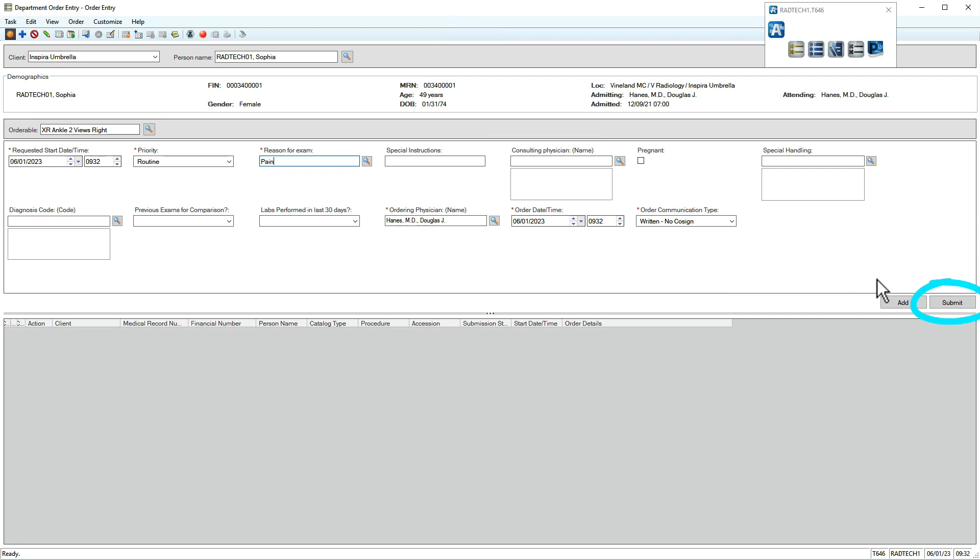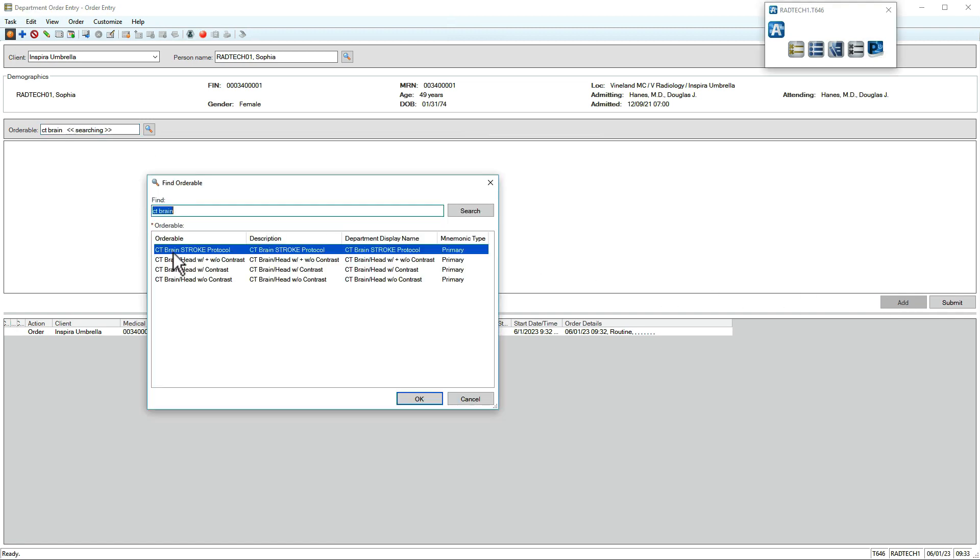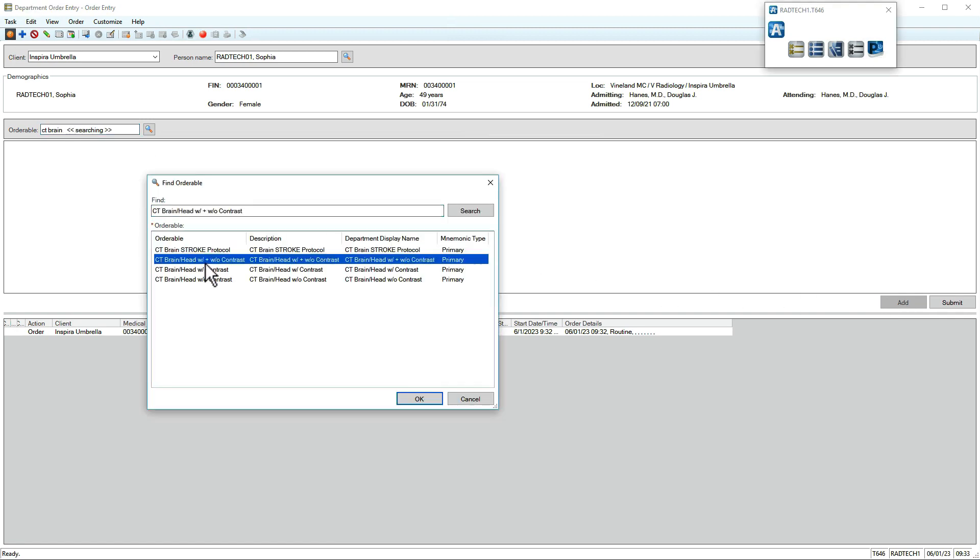If there are multiple orders, click Add. You can also include a body part when searching. Here, we've entered CT brain, so only CT scans of the brain display.